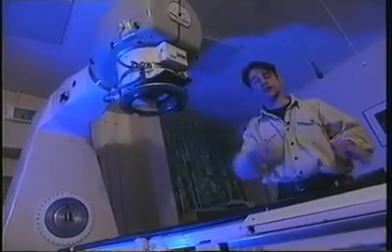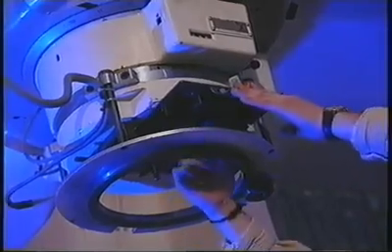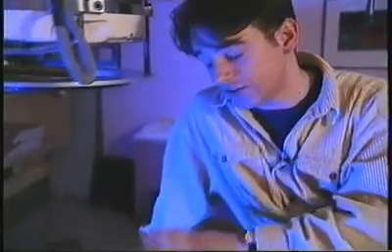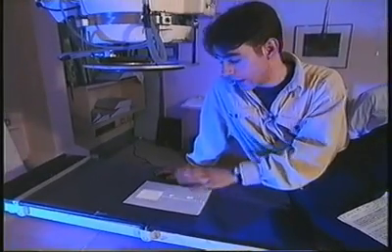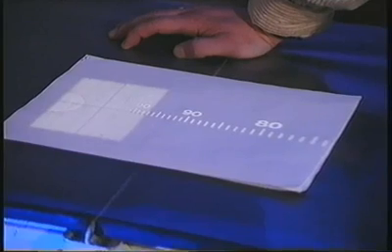Now, sometimes, as we saw in the planning stage, a wedge is needed, and this fits up here, and it controls the shape of the beam. Now, the patient lies up here on the couch, and everything is adjusted to ensure that the gamma rays are directed towards the tumour area. Now, this light that you can see here actually mimics where the gamma rays will fall when the shutter is open.